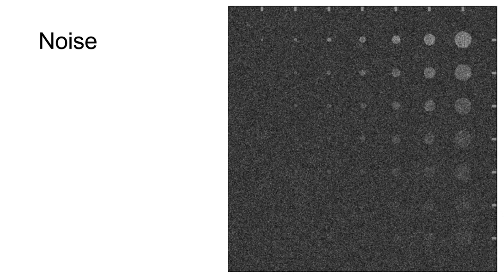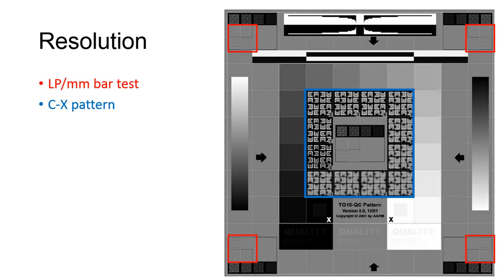Unfortunately, I was unable to download the template for the specific test, but I imagine it to be similar to this image. The suggested passing point is that in at least 3 quadrants of the screen, the majority of the square sections demonstrate the dimmest dot. Both the ACR and AAPM recommend minimum resolution for electronically displayed images of 2.5 line pairs per millimeter. The generic SMPTE pattern has a series of high contrast and low contrast bars of diminishing widths to check resolution.